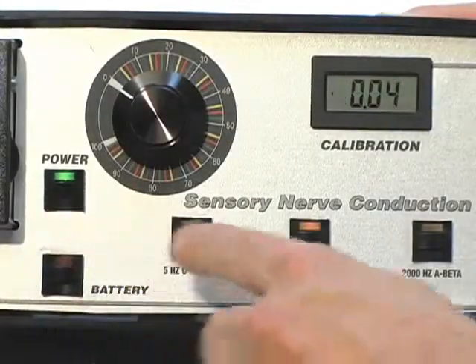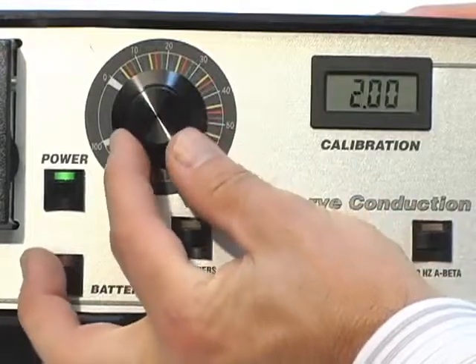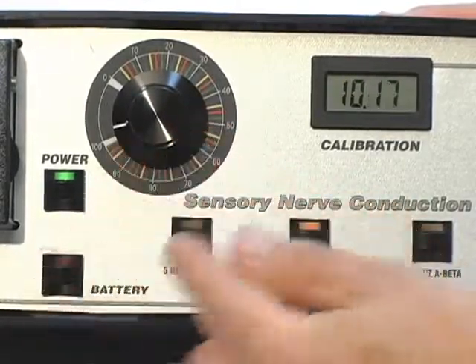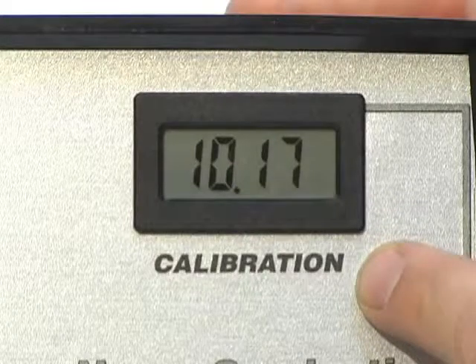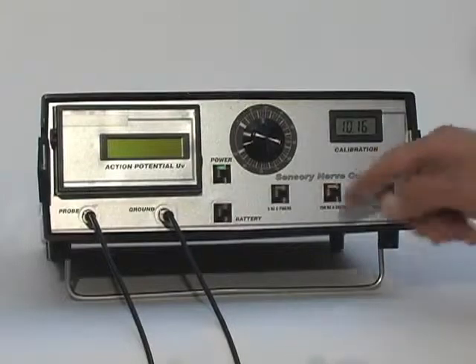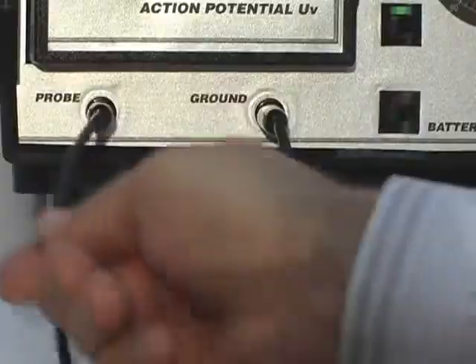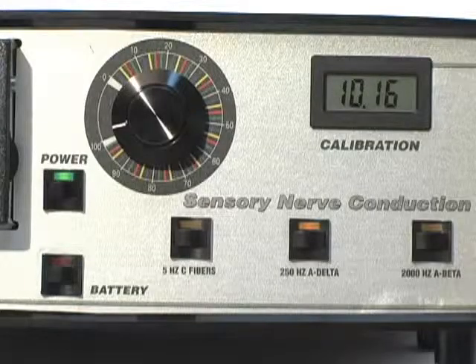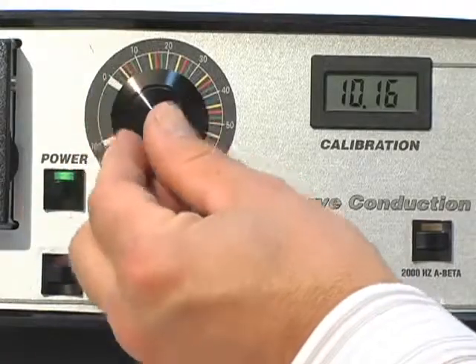Turn the power on and set the device to 250 Hz. Turn the dial to 100. The calibration LCD should read between 9.7 and 10.29. This shows the problem is not with the device. If it's lower than 9.7, replace the batteries as shown before. Now check the cable by flexing the end of it with your fingers and watch the LCD. Breaks in the cable cause the numbers to shift and may cause the device to shift to another frequency. This cable seems to be okay.